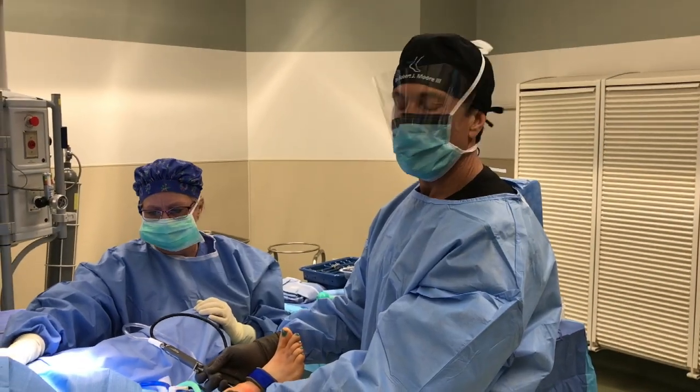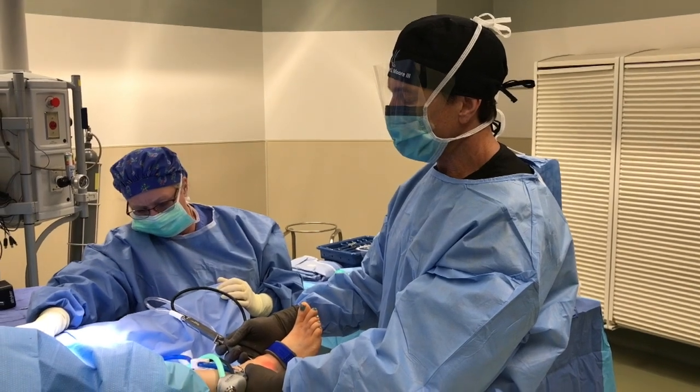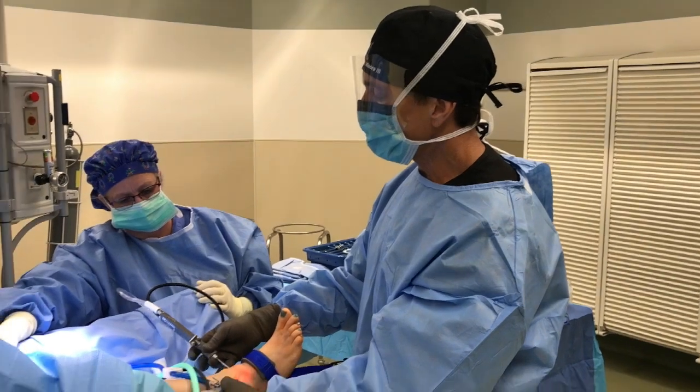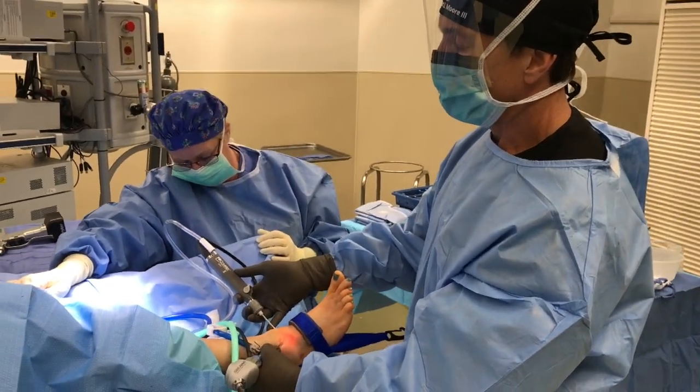Hi, this is Dr. Moore, and today we're going to perform an ankle arthroscopic procedure on a young lady with cartilage damage and something called subchondral fracturing. We're using the ConMed system, which has a great synovial shaver called the Gator.